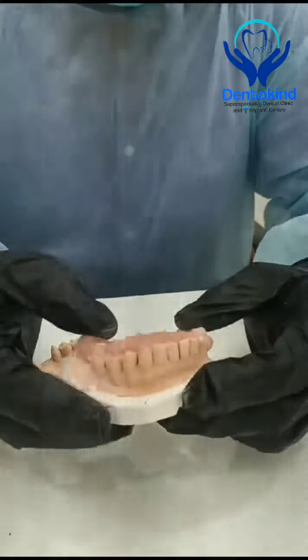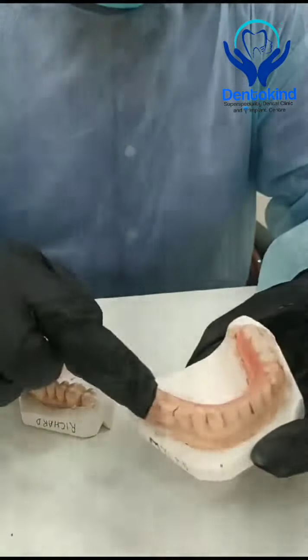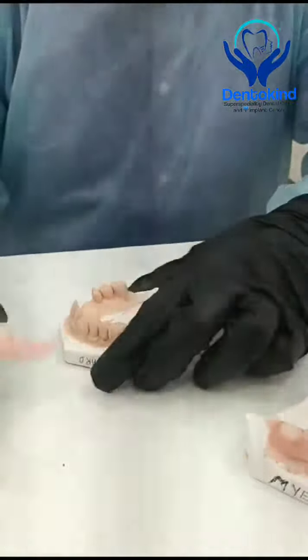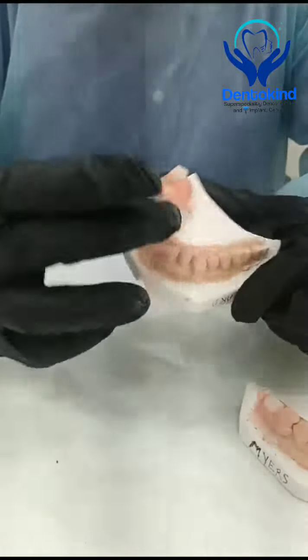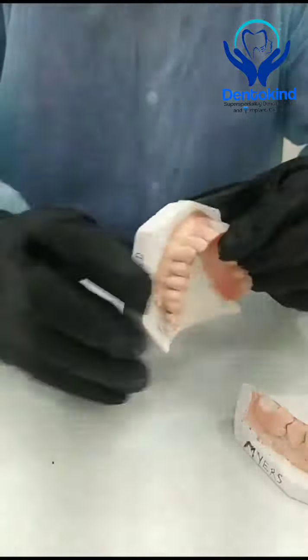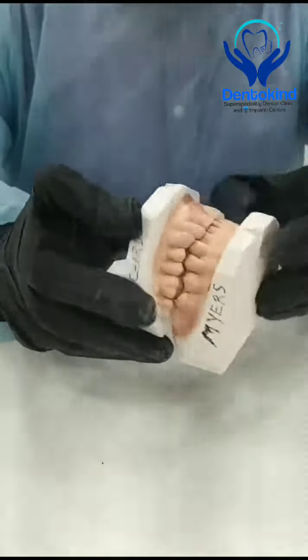You can see how it is attached to the gums and you can see the retention. The teeth are arranged all over in proper fashion. This is how the lower partial is attached, and you can see the retention.